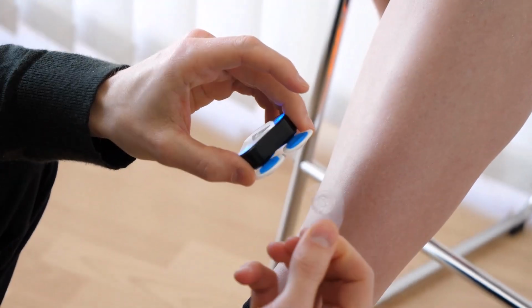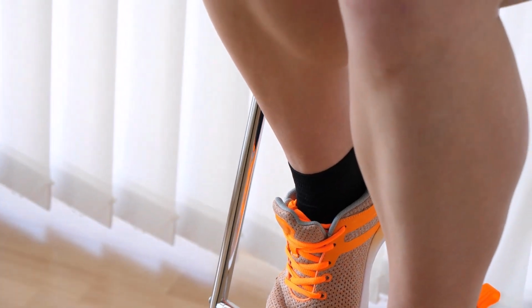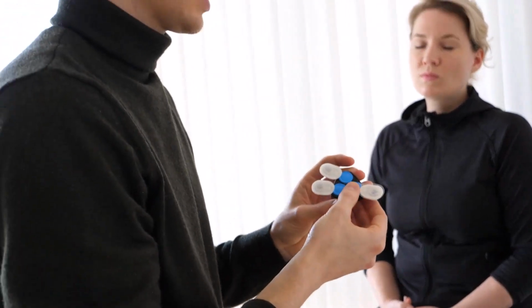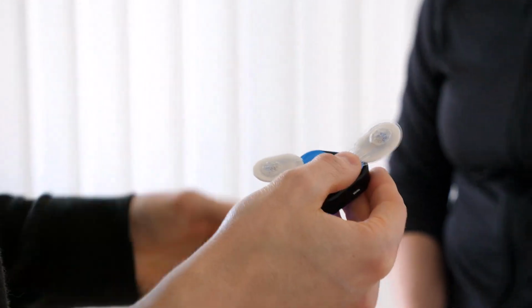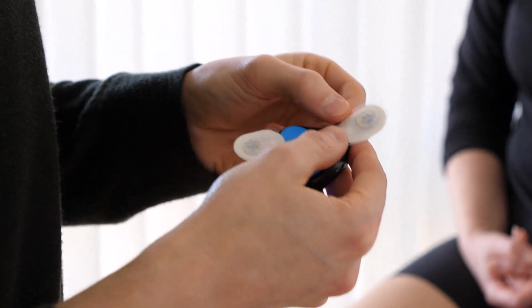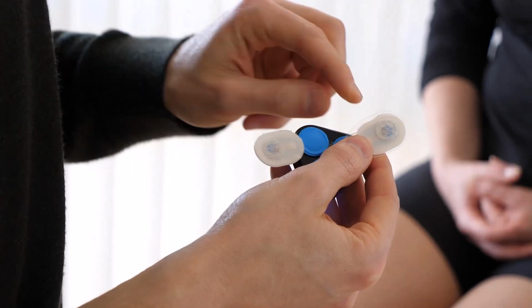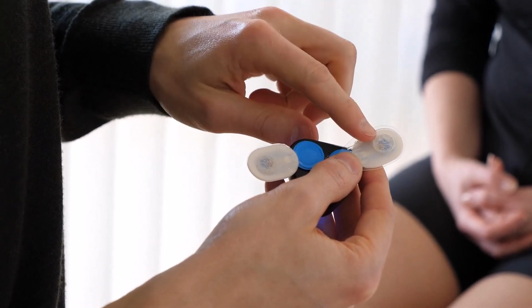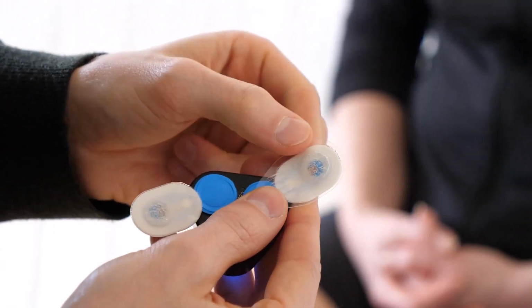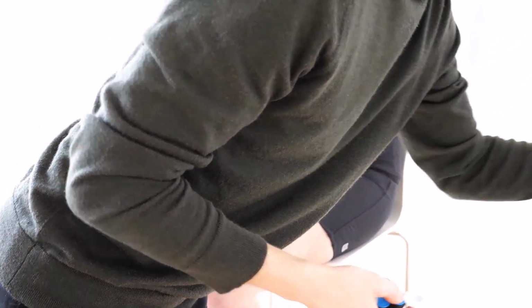To attach the electrodes, I remove the protective caps. Before I remove the last cap, I look at one more point that is particularly important to avoid measurement errors. It is about checking the humidity of the electrode. Since the cover is transparent, I can very easily judge whether the electrode is moist, which is mandatory for the measurement. This allows me to reduce errors before starting the measurement.